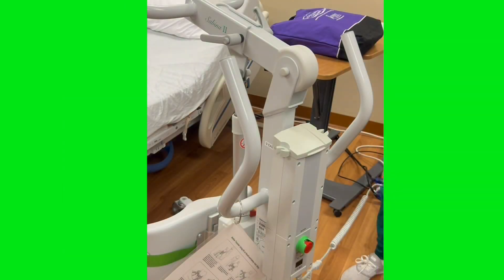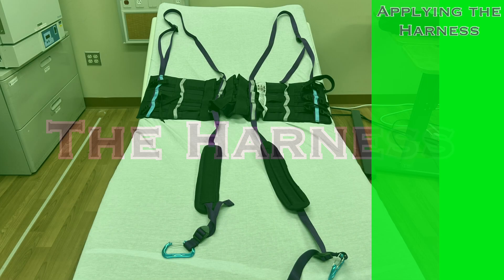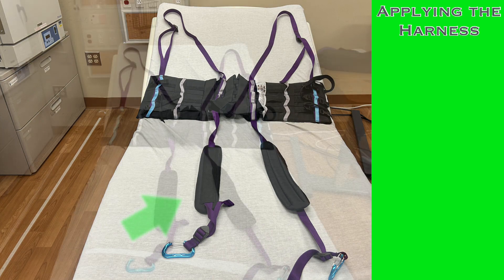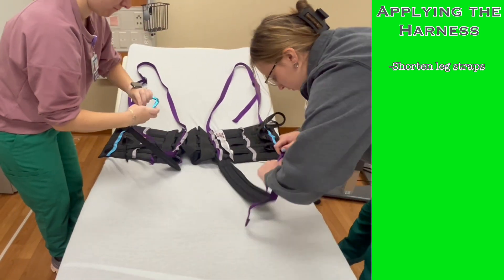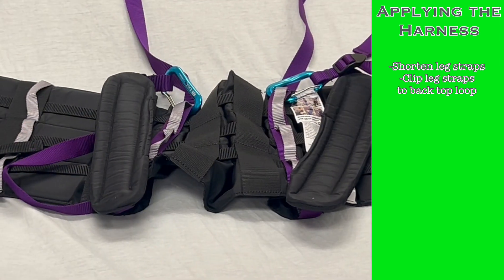Finally, as we move further up the machine, there are two large handles for the caregiver to use to steer and control the lift as you relocate your patient. To use the sit-to-stand, the patient will need to wear a harness that connects to the machine. The harness used at Trinity Livonia is a corset design. The straps that terminate with a carabiner are the leg straps that are not used when using the Sabina 2, so before putting the harness on, shorten those straps as much as possible and clip the carabiner to the topmost loop on the back of the harness to get them out of the way.